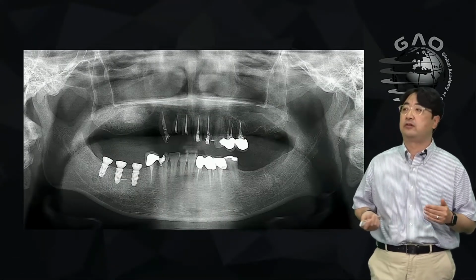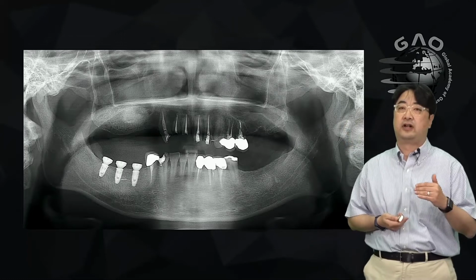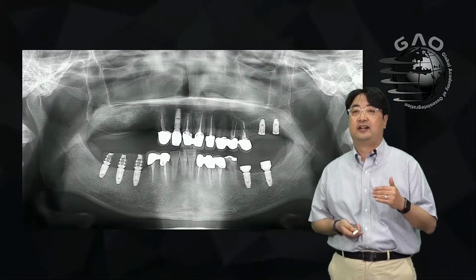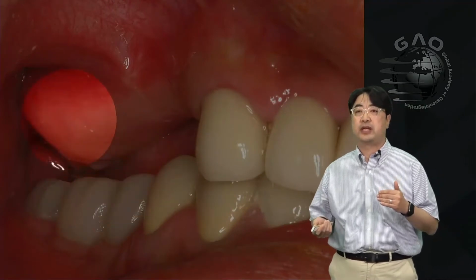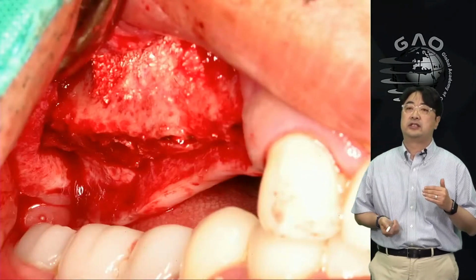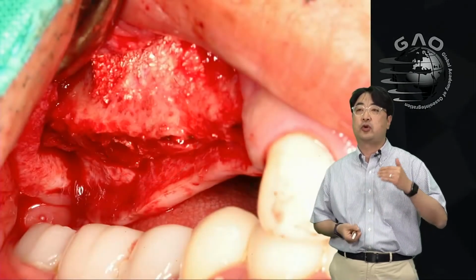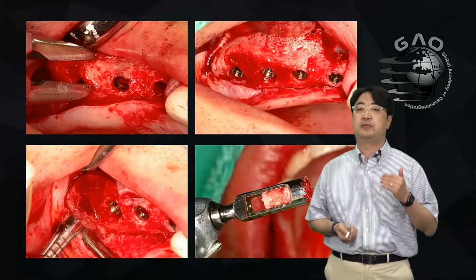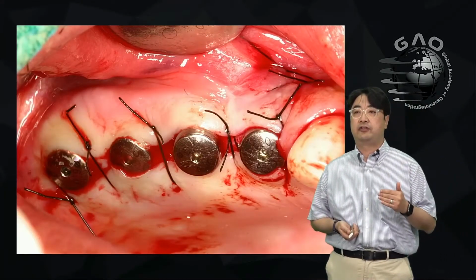This is the radiograph. As you see, the sinus on the right side posterior is already opaque. After a while he placed the grafts here and there. Now you can see, after he put the lower teeth, how much space we have. We don't have that much space on the posterior here, right? This is the picture at the surgery. As you see, he removed the cortical bone from the top. Then he placed the implant, and he did some trephine biopsy. And this is how it looked after implant placement.